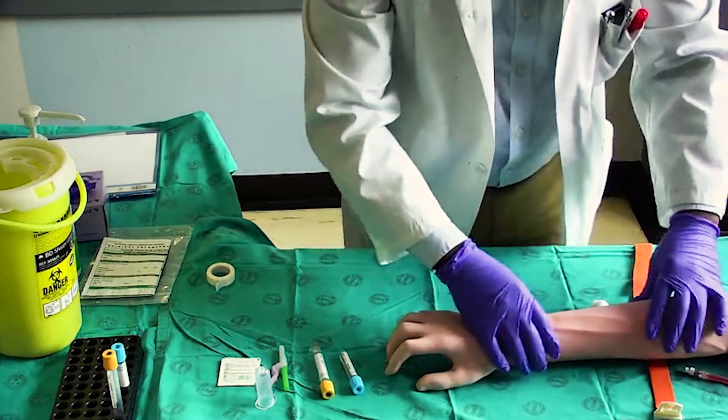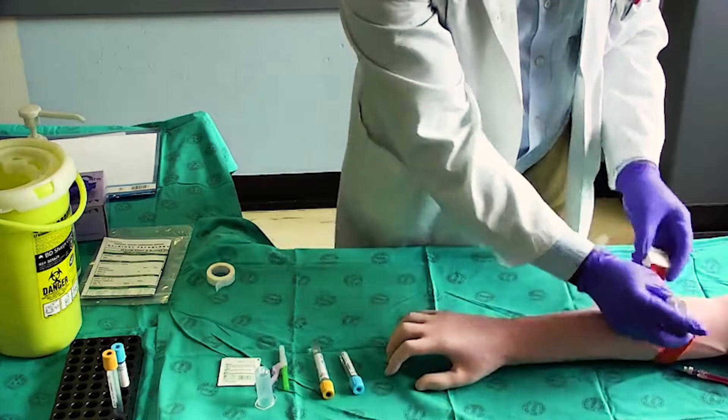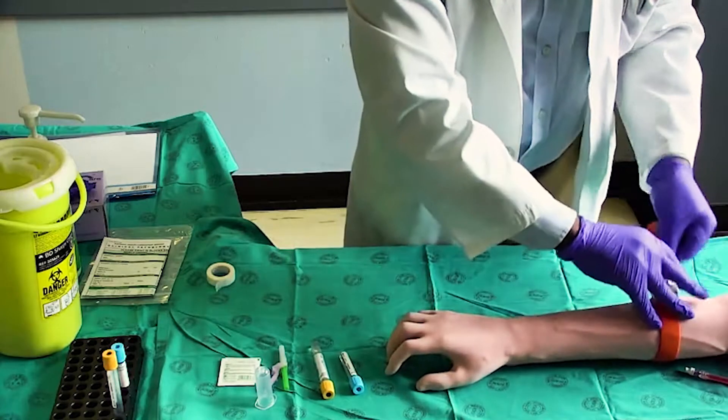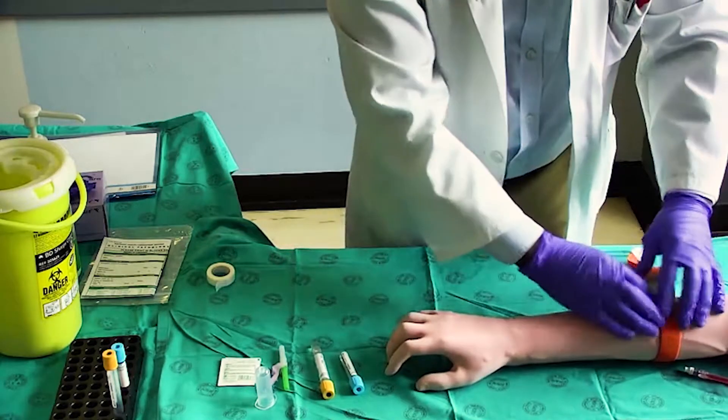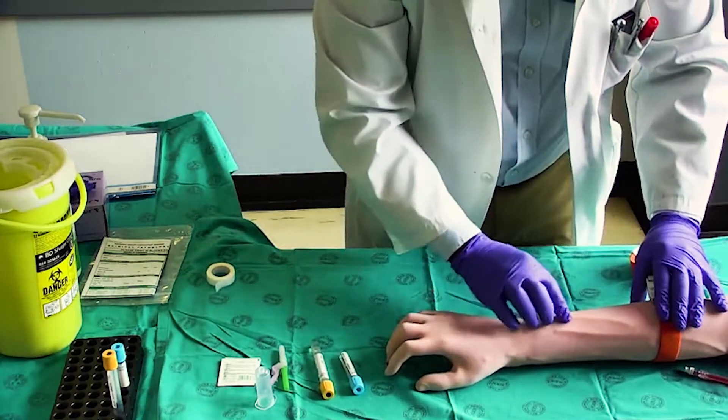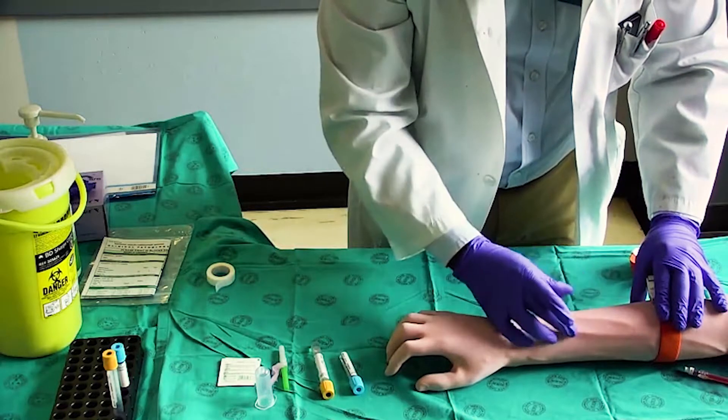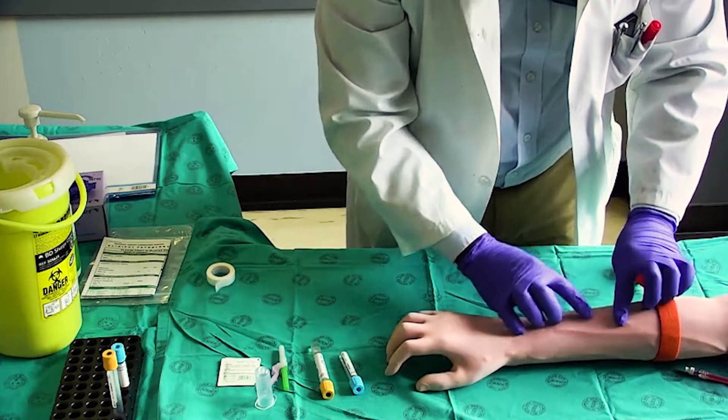Extend the patient's arm and inspect the antecubital fossa or forearm for suitable veins and for scars, wounds, and or infections. Apply the tourniquet four to five finger widths above the antecubital fossa. Locate and palpate a suitable vein.